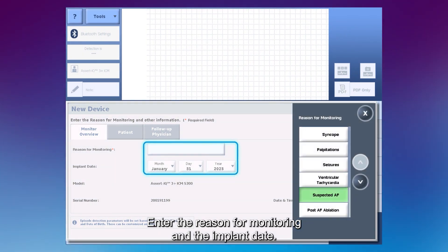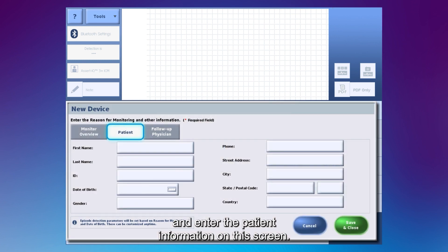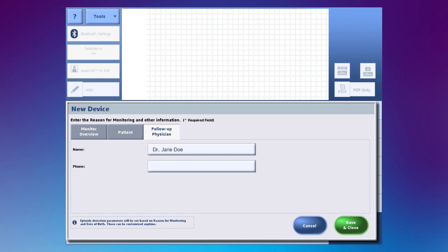Enter the reason for monitoring and the implant date. Select the Patient tab and enter the patient information on this screen. Finally, select the Follow-up Physician tab and enter the appropriate information. Once finished, select Save and Close to continue.